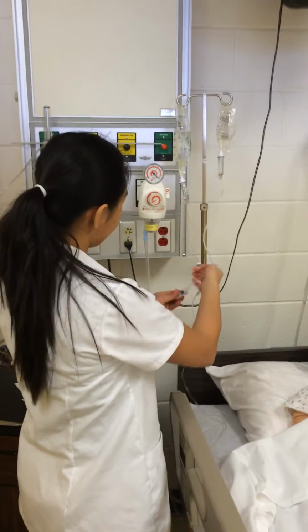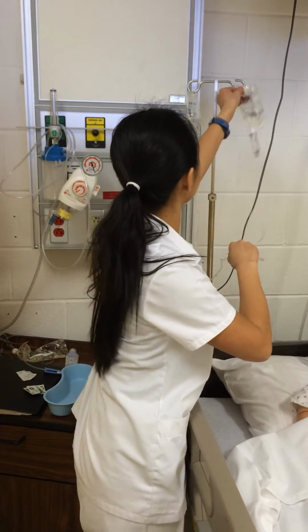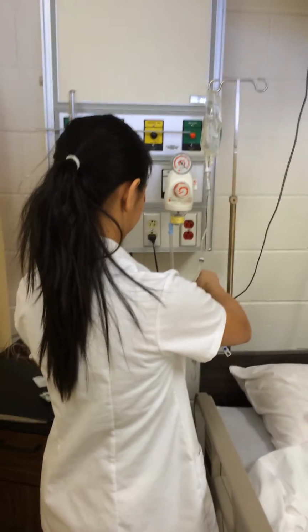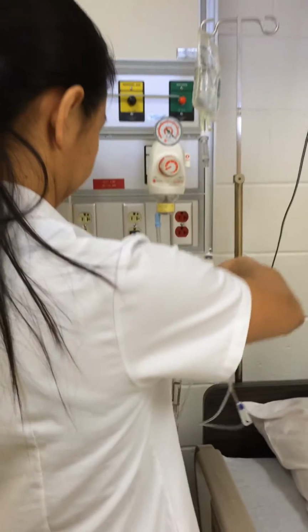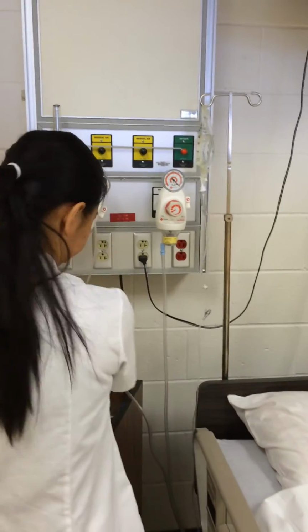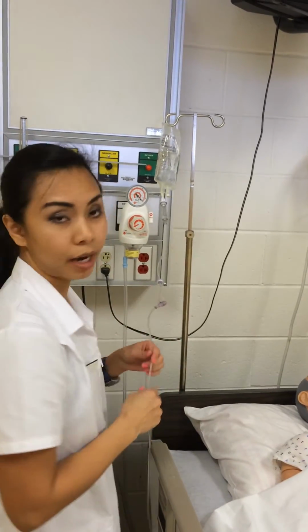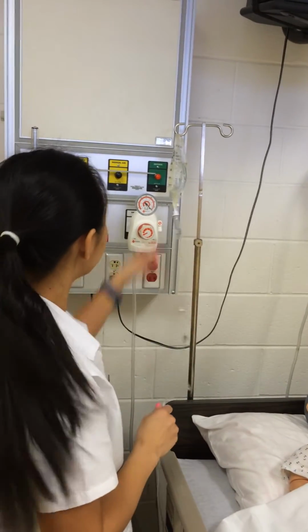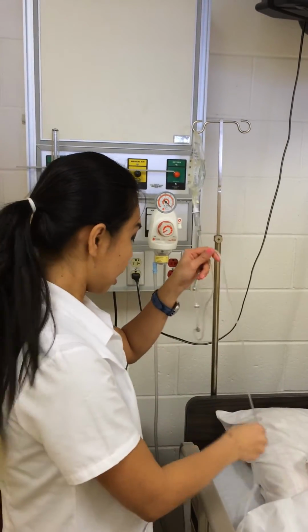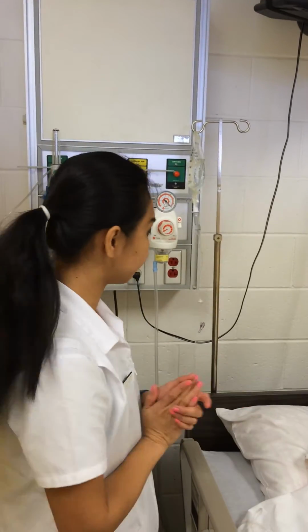So I stop the medication and remove it. And I will recalibrate the drip factor for the primary IV. Go back to 60 drops per 1 minute, as at the beginning.